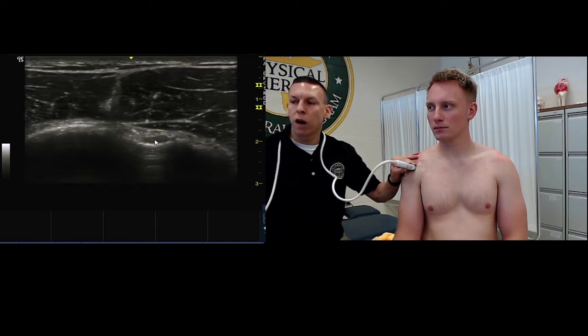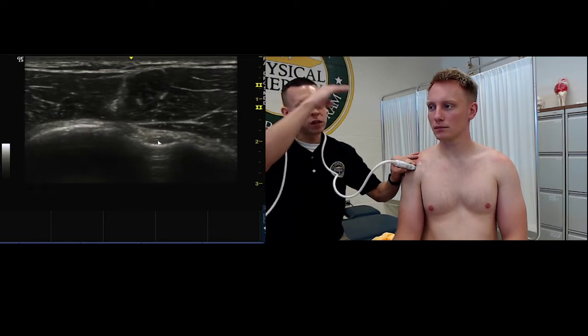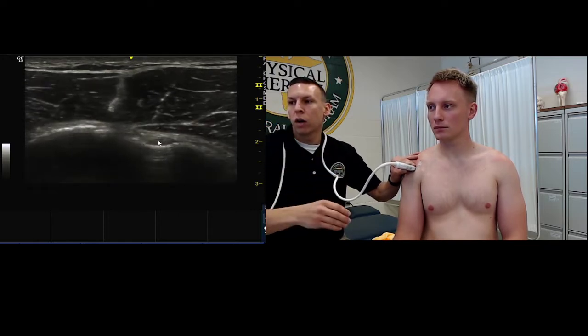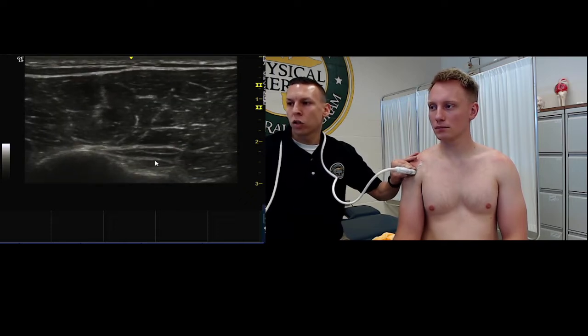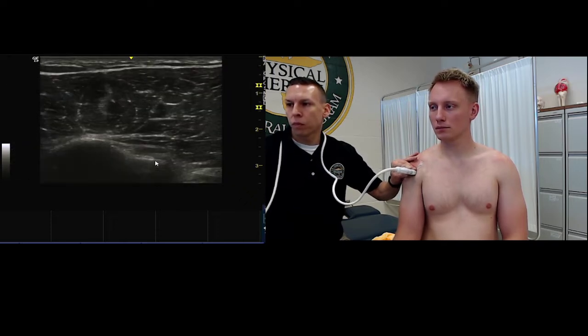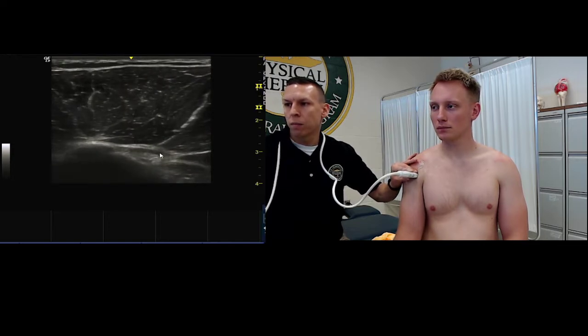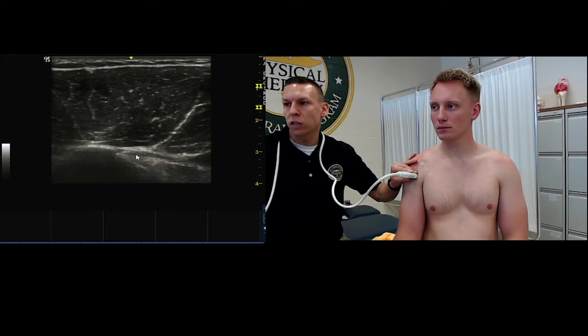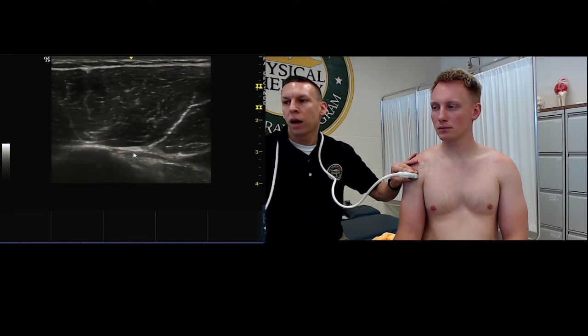Once we've identified it, we want to slide the probe both cephalad and caudal. And if we start going caudal, we're going to change our depth a little bit. Further down, you'll start to see a tendinous structure going from medial to lateral, and that's going to be your pec tendon.